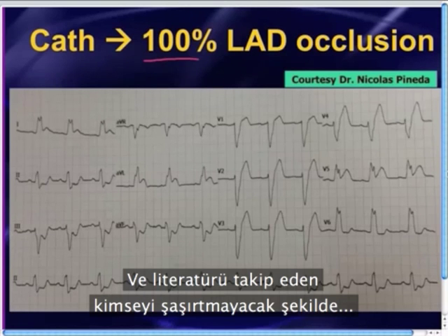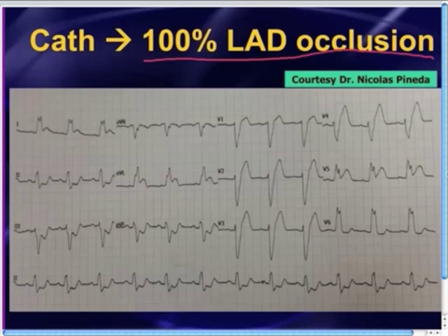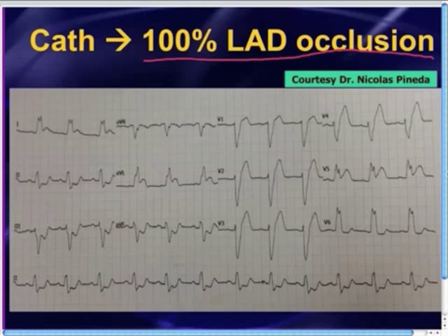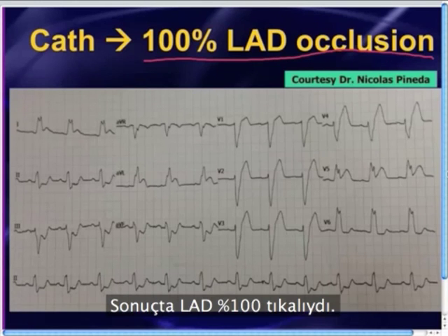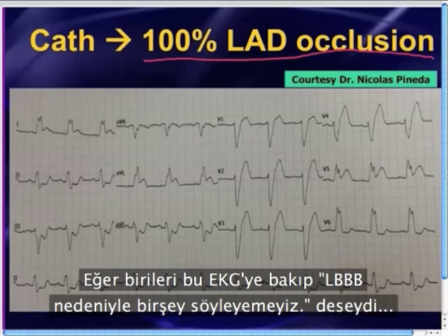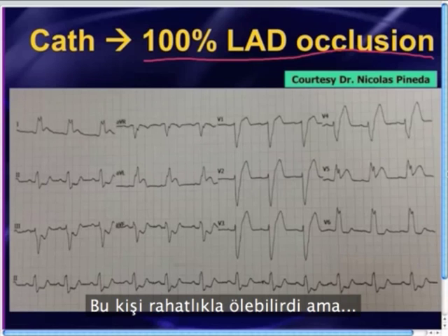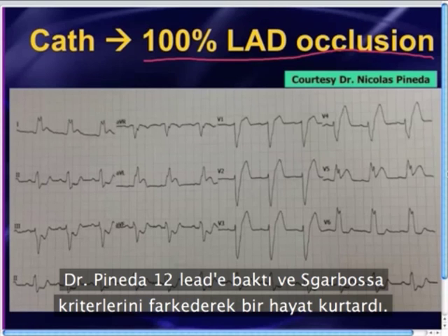No surprise to anyone who keeps up with the literature: this patient went to the cath lab and had a 100% LAD occlusion. If somebody had simply looked at this 12-lead and said 'it's a left bundle, we can't tell anything,' this person could very well have died. But fortunately, Dr. Pineda looked at the 12-lead, knew Sgarbossa criteria, and saved a life. Good job.